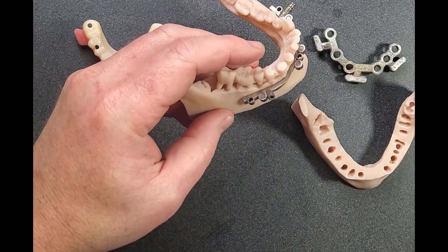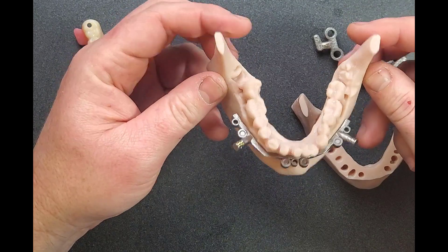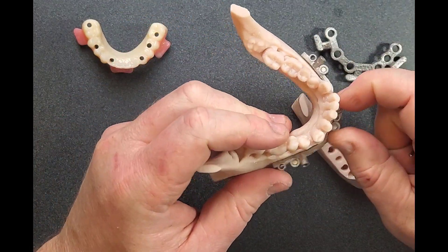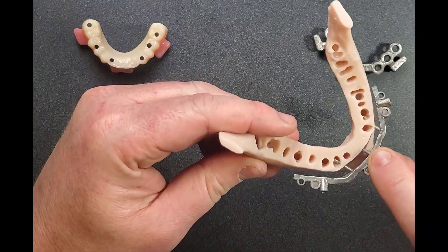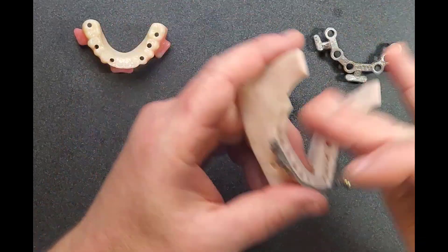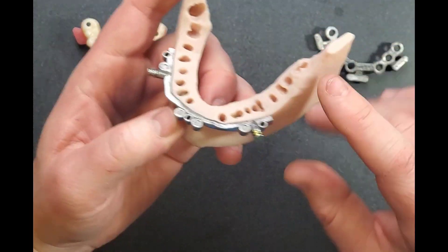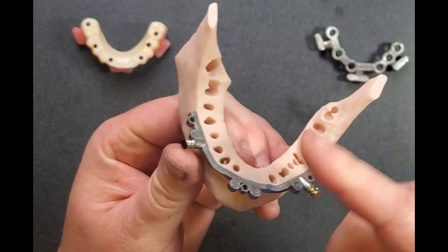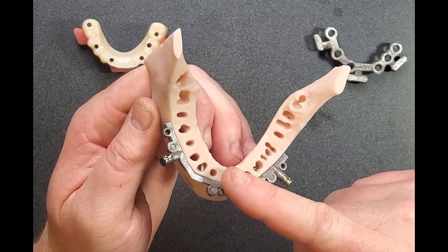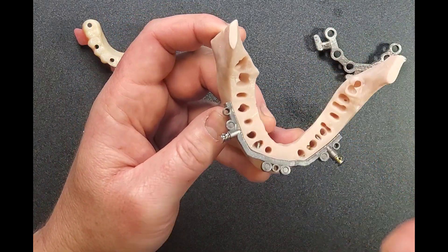So once I drop in the posterior pins — remember the holes having already been drilled — you've only got two pins to deal with. Now that's stable, that's in there. Pull your teeth, do your bone reduction. I've got a separate model that has the bone reduction completed, so imagine we just did bone reduction and now things would look like this. This would be where you're at after your bone reduction — you're simply reducing the bone down to this level. And even though the bone reduction goes a little posterior to that, this is giving you the trajectory and you can just continue on. There's no need to lay an excessive flap all the way back for that. Really that's beyond the level of where your prosthetics are going to go. Just follow the trajectory and then taper it up into the ramus.